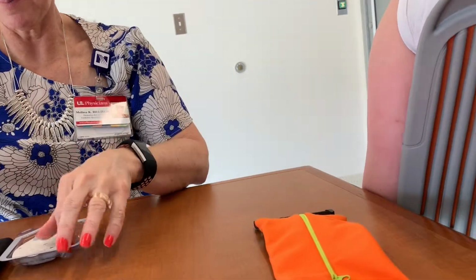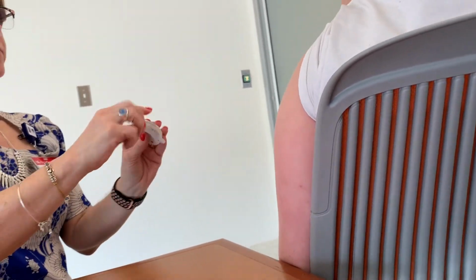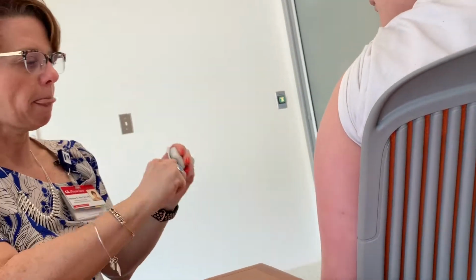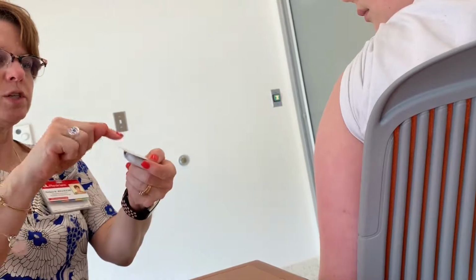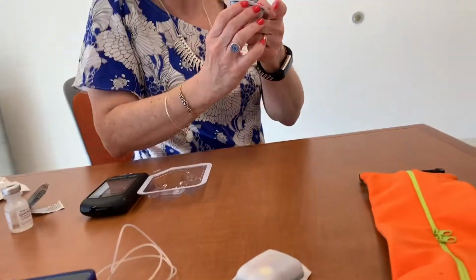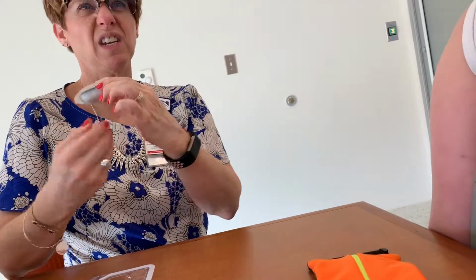I'm just using alcohol today. Right. I'm just going to throw the alcohol pad at Mason. We're going to let this dry. Okay. So what I'm going to do, this is the little cap for the, I call it the cannula hole. The cannula window, or the straw window. That comes off, and we shouldn't see anything sticking up, right? So that's good. And then I'm going to take the tape off. So it's sticky like Dexcom, but sometimes it needs a little help.